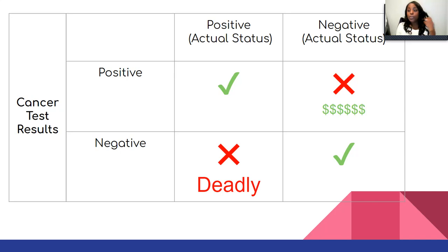And then also you could be ineffective, causing a loss of good treatment time, doing something else that could have been more effective, maybe something more natural, or because you really don't have any other antibiotic after a carbapenem. So if you find out that this is not going to work on an agar plate, it's so much better, and it's a lot less money and time and effort rather than treating the patient and realizing it does not work.